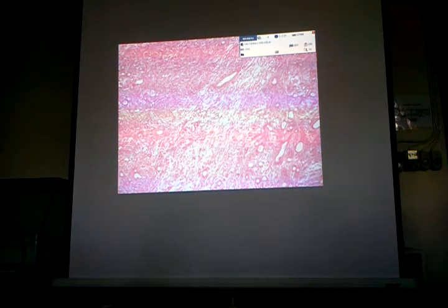However, the dense irregular fibrous connective tissue will be accompanied by mucin material, which is a feature of a myxoid stroma. And because we are seeing different types of cells and tissue composing this tumor, there are many types of cells and tissues present.